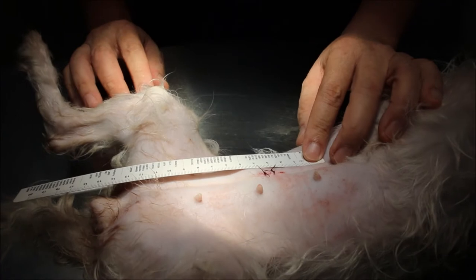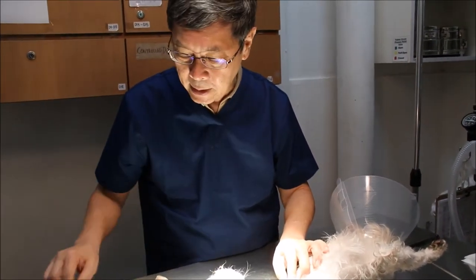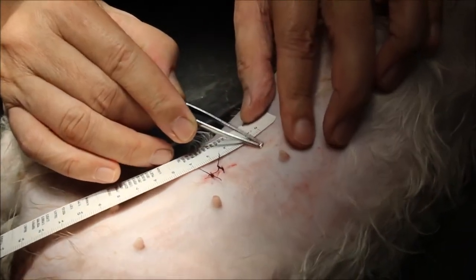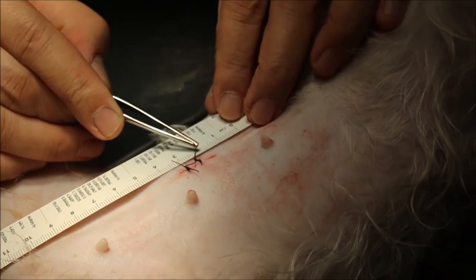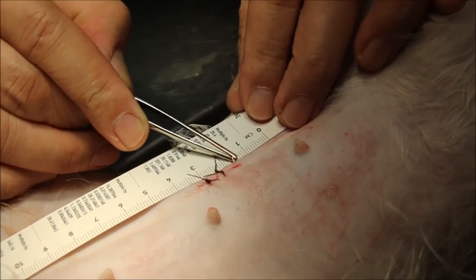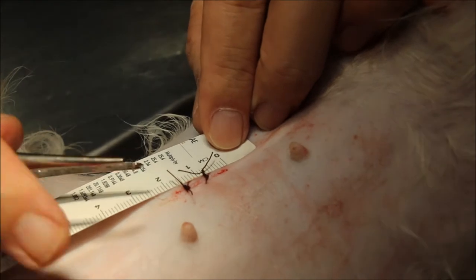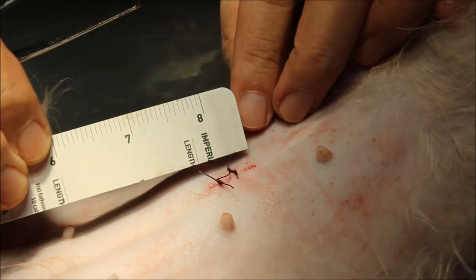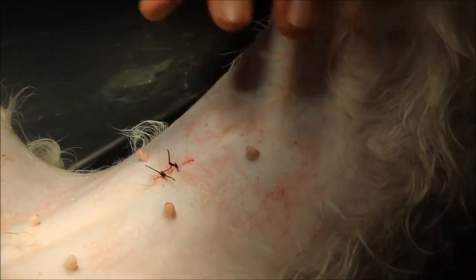The spay was done about half an hour ago and I'm doing this video to teach younger vets how to spay a dog with the minimum length of skin incision. I look for the umbilical scar — this is the umbilical scar, which is where the umbilicus was. For this small breed, I estimate about 1.5cm from the umbilical scar. My incision starts 1.5cm from it, and I tilt the scalpel blade and cut about 1.8cm — this is the shorter skin incision available to take out the ovaries and the uterus.